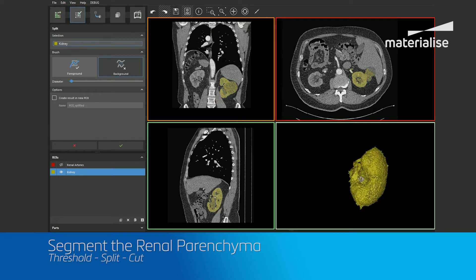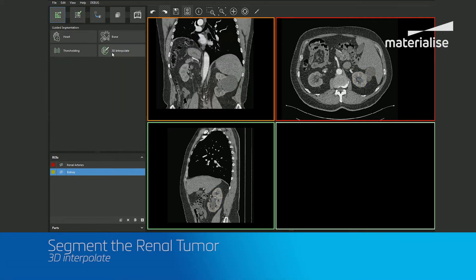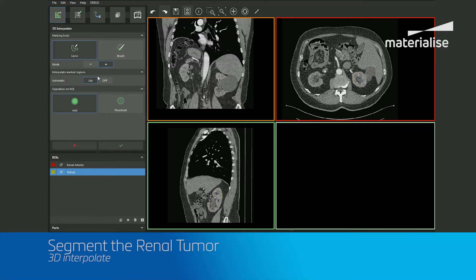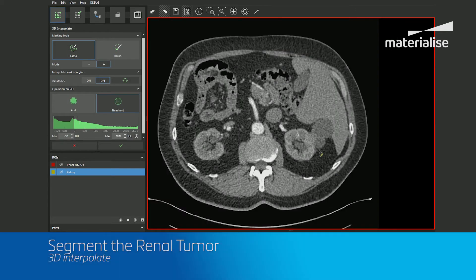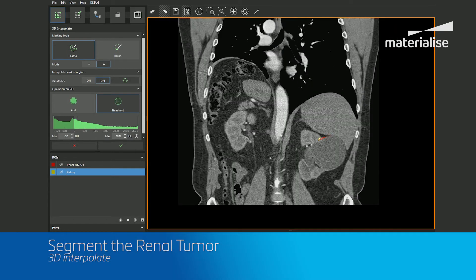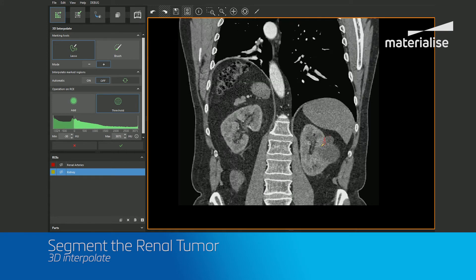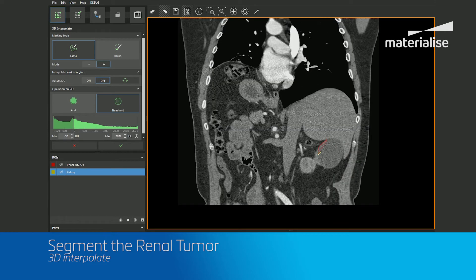Now that we have the kidney isolated, let's add the renal tumor by using the 3D interpolate tool. I chose this tool instead of thresholding because the tumor has a relatively regular shape and less contrast enhancement than the kidney and arteries did. If you prefer, you can turn the automatic interpolation off and begin outlining the tumor margins with either the brush or lasso.